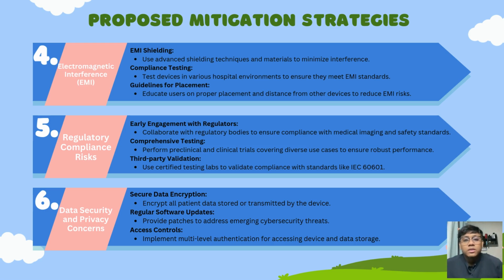Next, compliance testing. Test devices in various hospital environments to ensure they meet EMI standards. For the last, guidelines for placement. Educate users on proper placement and distance from other devices to reduce EMI risk.